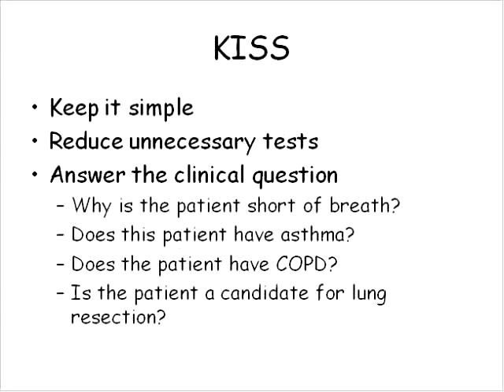Dr. Bob Crapo, who many of you may recognize, showed us years ago that the more parameters that you provide on a pulmonary function report, the more likely you are to find something that appears to be abnormal, and whether or not that really helps with the patient's diagnosis is probably questionable. So I think the key to avoiding that syndrome is to do just those tests that are necessary to answer the clinical question asked of the test.